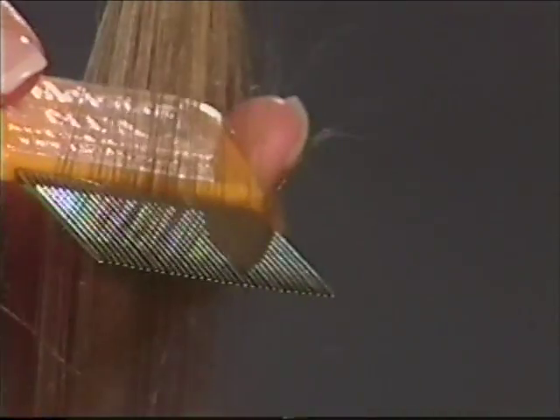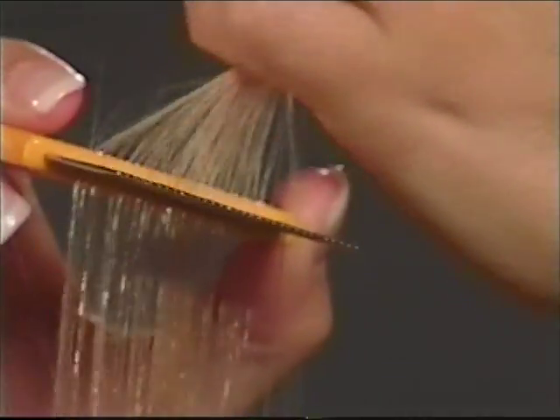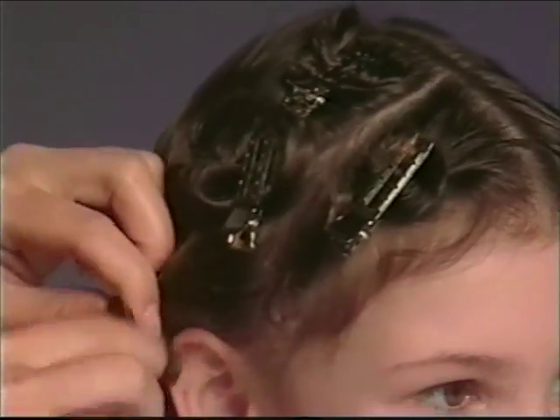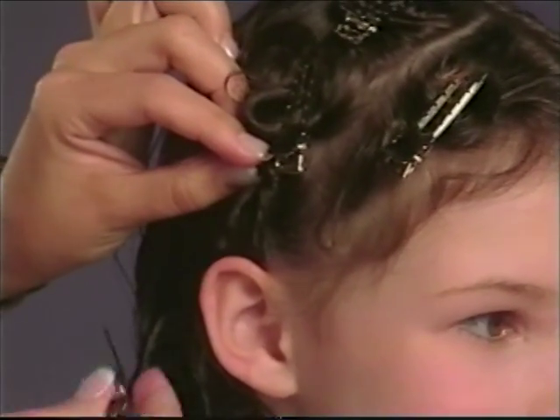Pull the comb through the hair from the scalp all the way to the end of the hair until the section is completed. If you find a nit, don't wait — snip it out with a pair of safety scissors. When you are satisfied you have completed a section, twist, clip, and separate the section from the rest of the hair.